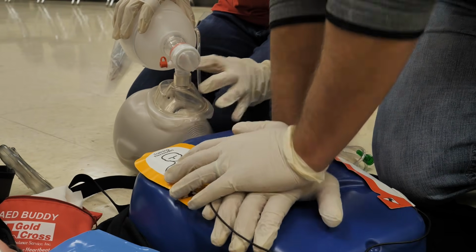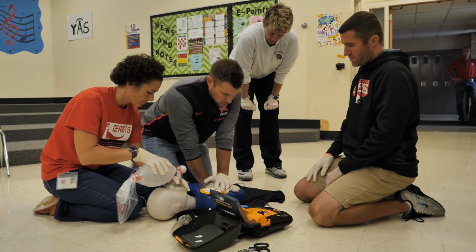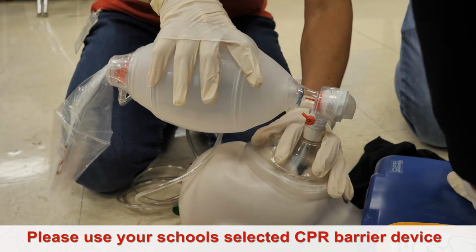13, 14, 15, 16, 18, 19, 20, 21, 22, 23, Continue care. 25, 26, 27, 28, 29, 30. I got the next one, Brad.